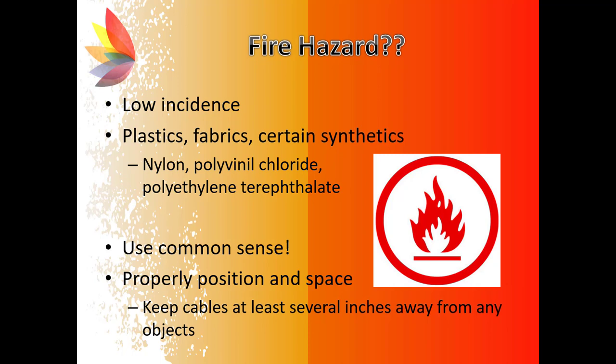With the use of shortwave diathermy, there is a slight risk of fire hazard. This is mostly related to clothing choices of a patient, and then the application of diathermy. Although the risk of fire is a relatively low incidence, it is something that needs to be considered and discussed within the application protocol. Clothing options that are best for diathermy application are materials made of cotton.